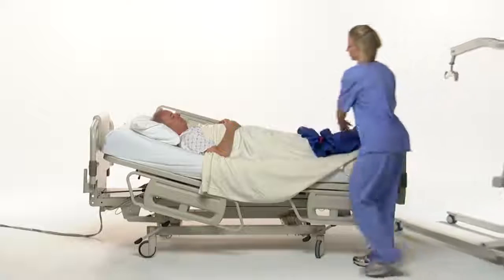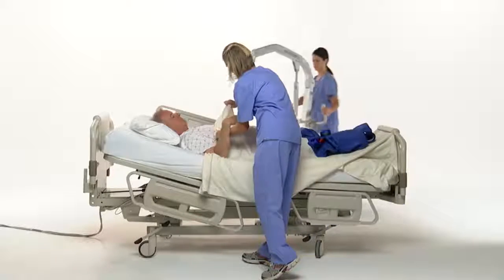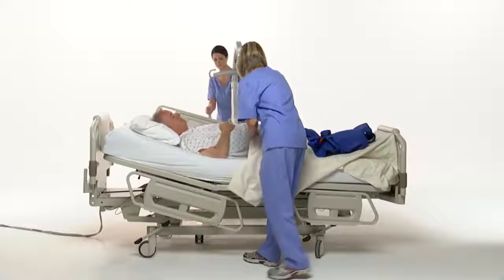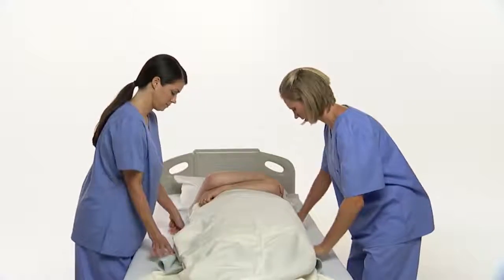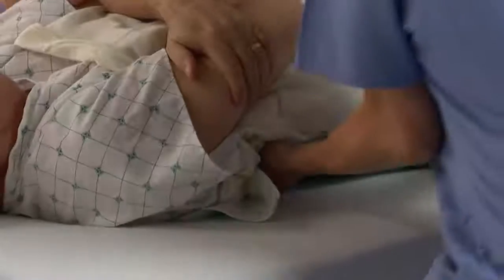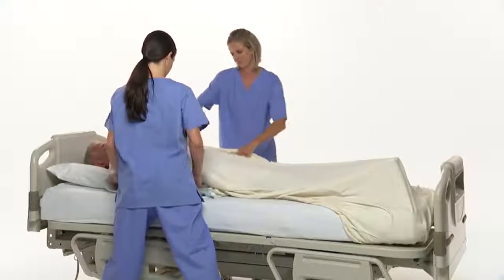Many products have been developed to address this problem. However, these devices can be cumbersome to use, often requiring multiple operators, and can still put the patient and caregiver at risk. The lack of an effective product to solve this problem ultimately results in caregivers manually repositioning their patients, risking back, neck, and shoulder injuries, while distracting them from their primary caregiving responsibilities.